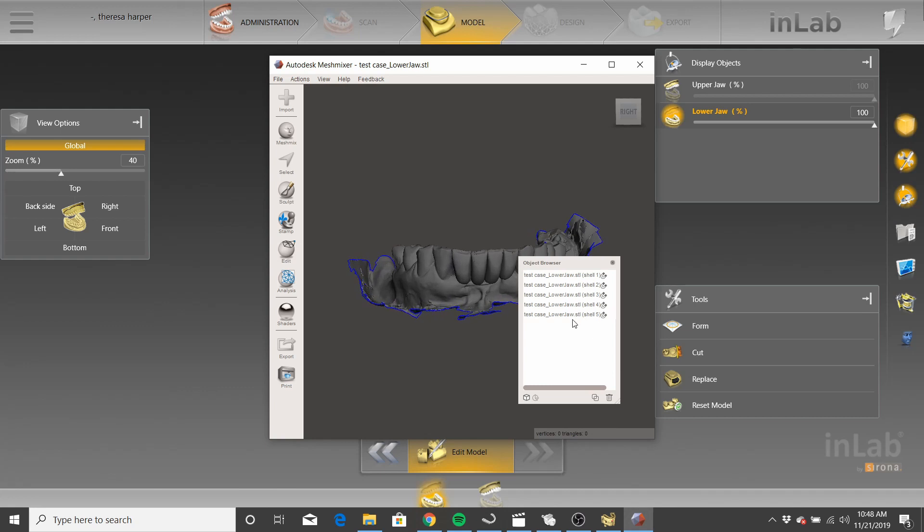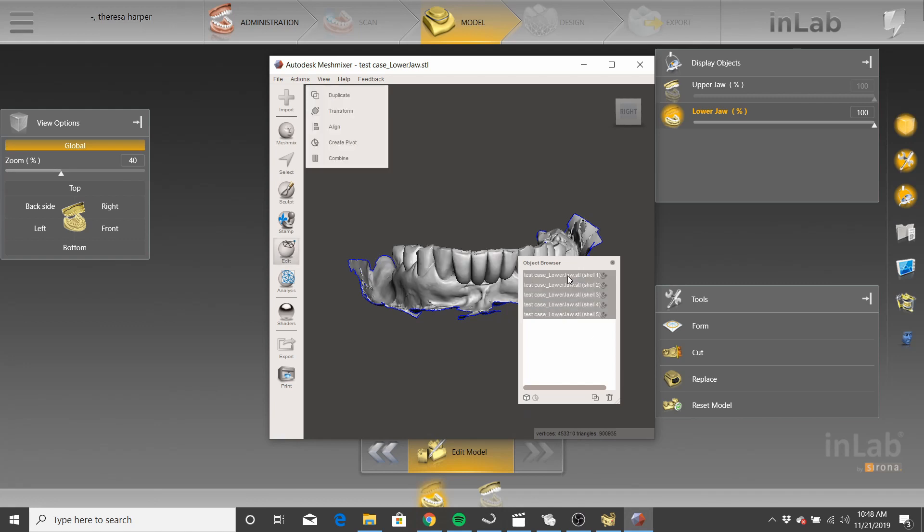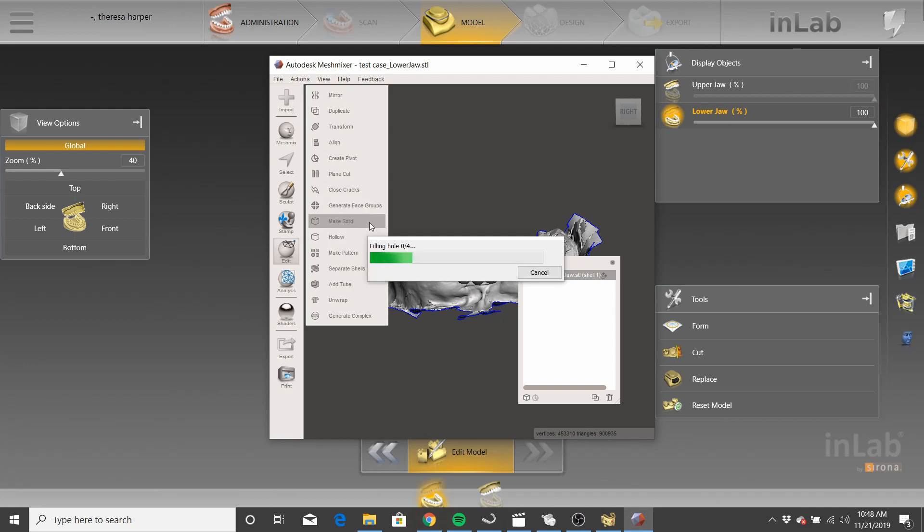And then we're going to, let me see if I remember this correct, because I don't want to throw you guys off too. Okay, we're going to select all the shells. We're going to click combine. So we've got this one shell. Now, we're going to go to, we're not done yet. We're going to go to make solid. Okay.